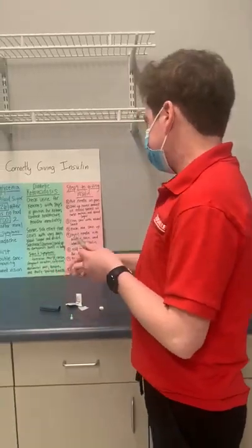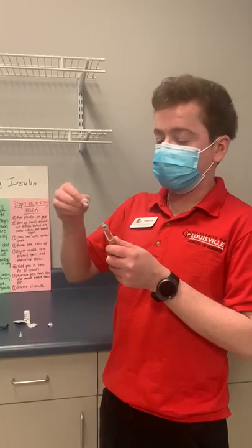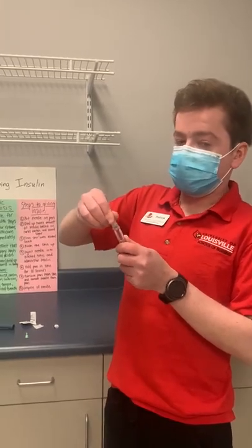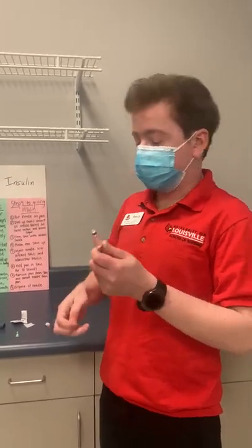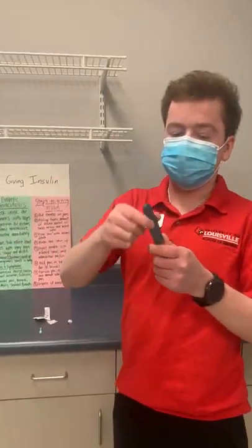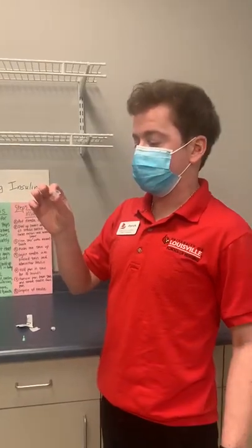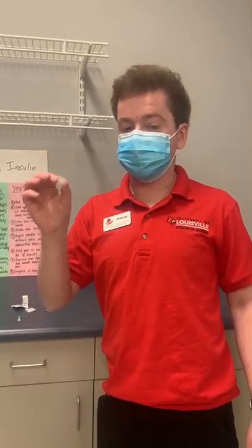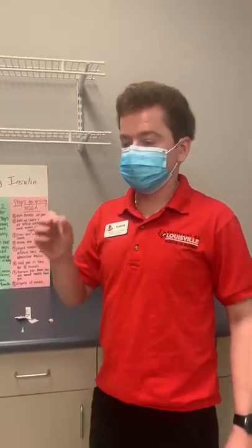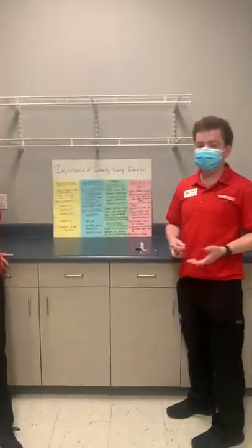And then after you remove it from your skin, you also want to remove the needle. And you do that by putting the cap back on and unscrewing it the other way. And then you can recap your pen with just the plastic covering. And then you want to properly dispose of the needle because this is a biohazard and you don't want it to stick anybody else. So that's the importance of correctly giving insulin and how to give it.